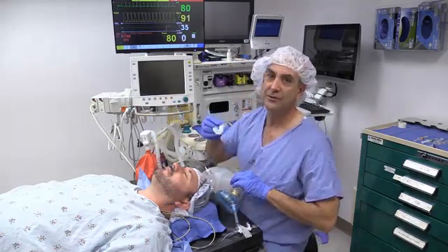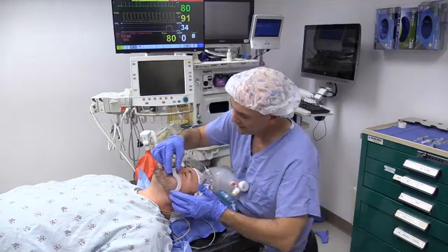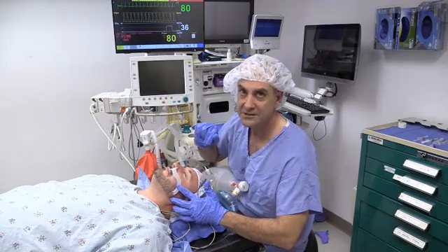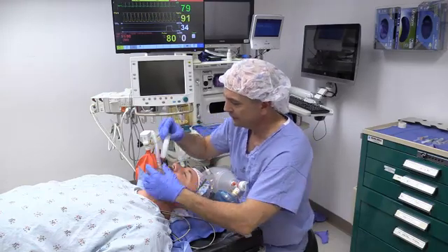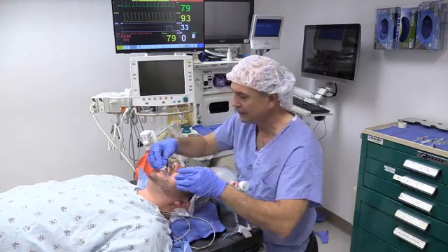What I'm then going to do is size an oral airway and place one. From his mouth to the angle of his mandible, this is an appropriate sized airway for him. I'm going to open his mouth and then go ahead and insert the oral airway.